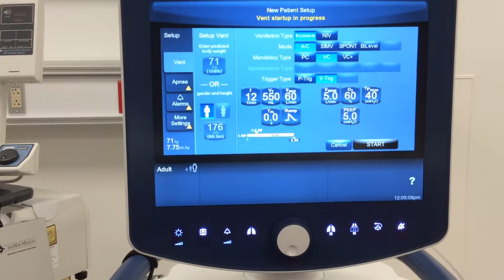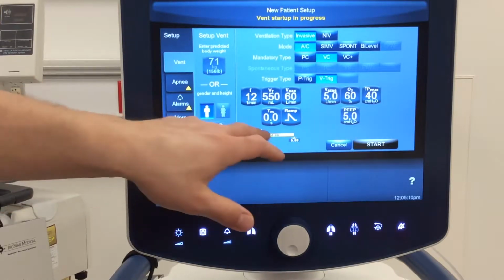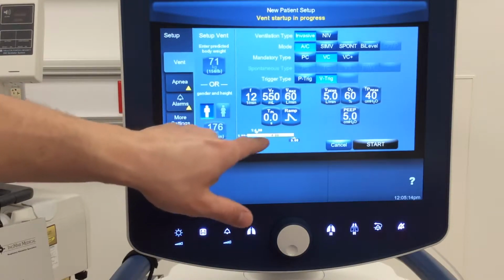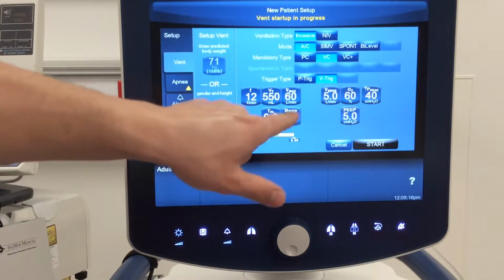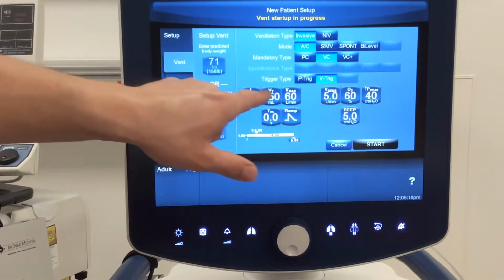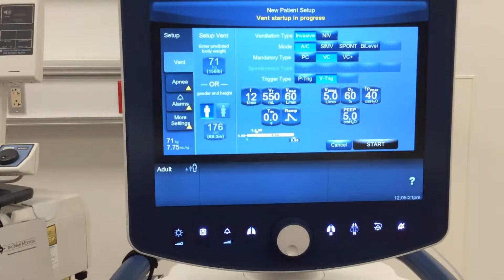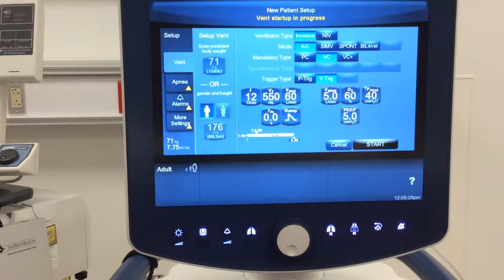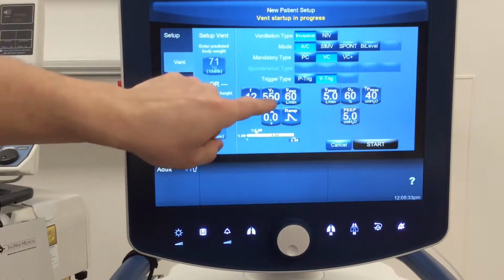Sometimes we'll go a little bit lower. Sometimes we'll go a little bit longer. Okay, should have a sufficient amount of expiratory time here. 4 seconds, 1 to 4 I:E ratio. No built-in pause time. Should my patient want to breathe faster than 12 breaths per minute, they absolutely can do so. All they have to do is pull 5 liters a minute of inspiratory flow. So that diaphragm pulls down, makes that little flow change at the ventilator Y. Ventilator senses that, and it's going to kick in a breath.